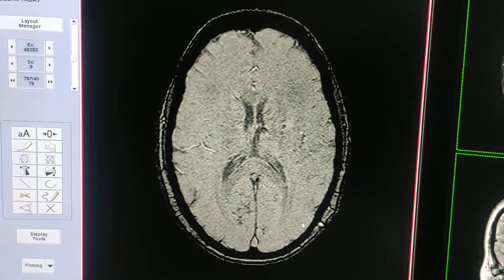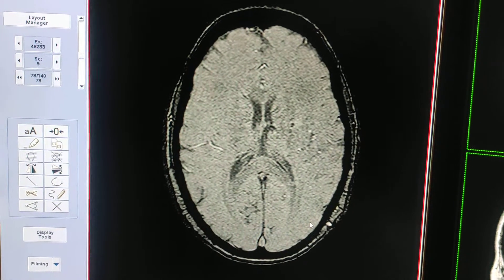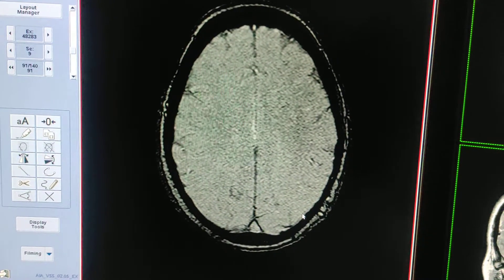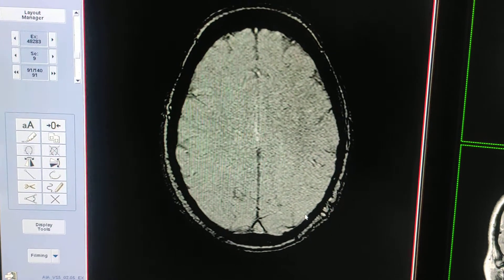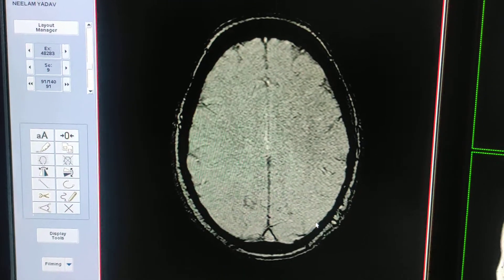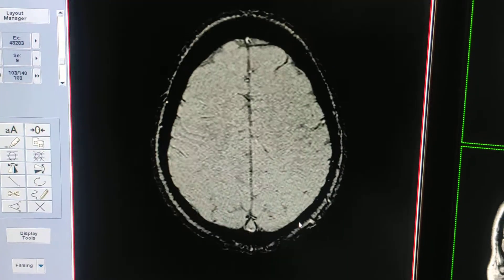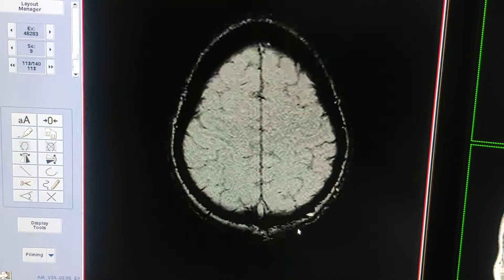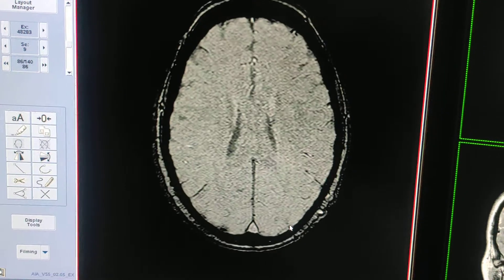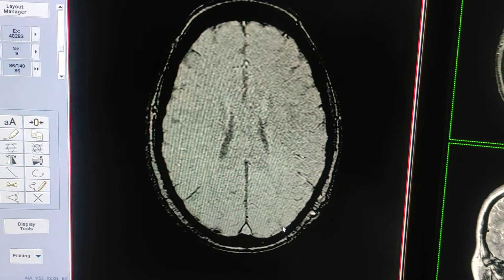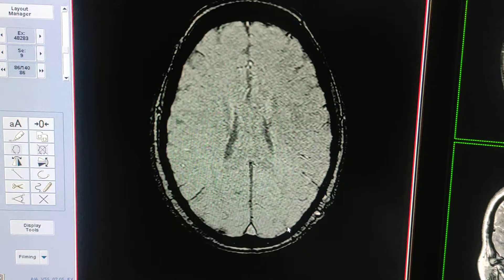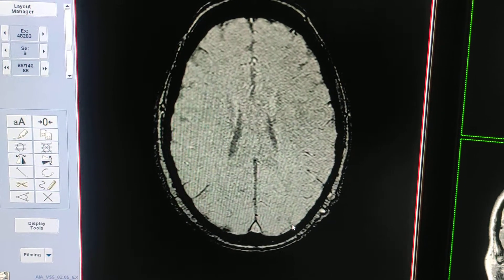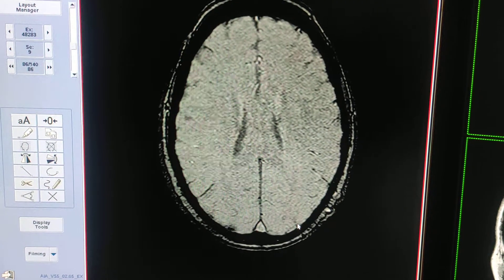It can also be used for chronic multiple sclerosis lesions, where it sometimes represents iron depositions. For neoplasm lesions like glioblastoma, to see whether there is calcification or hemorrhage. Then for hemorrhagic disorders like hemosiderins or amyloid angiopathies, and neurodegenerative disorders in which intracranial calcifications or iron depositions need to be ruled out.